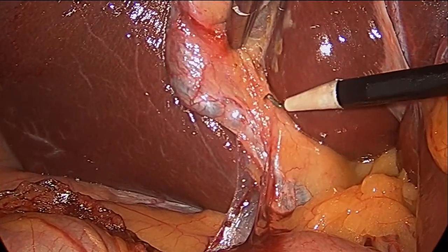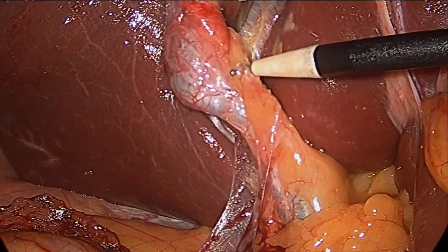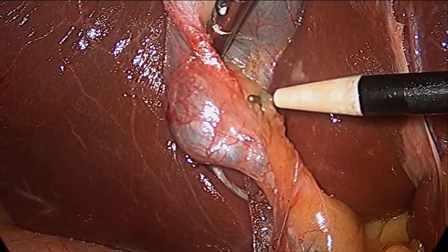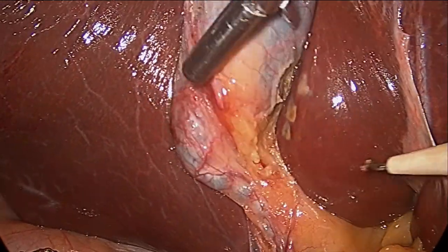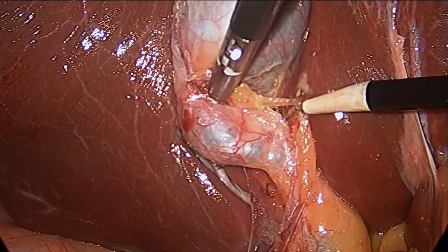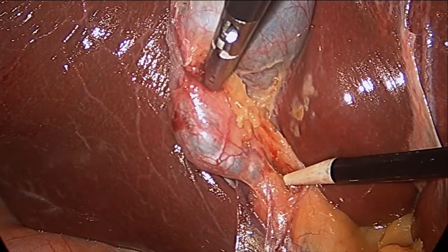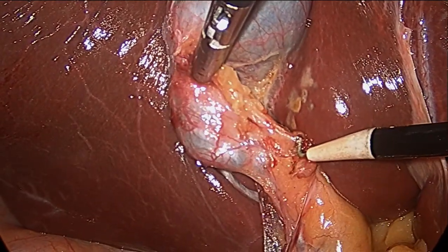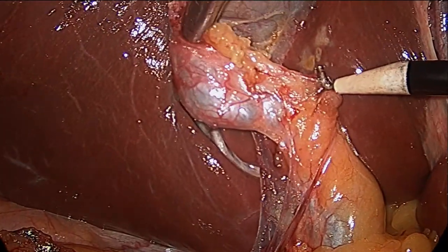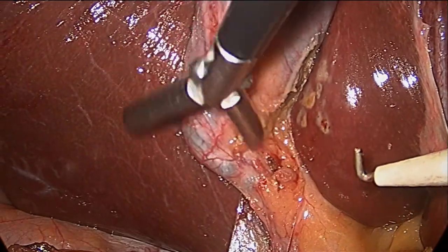When performing a cholecystectomy I always use a hook — I think the hook is the most convenient and safe tool for this operation. Continuing the dissection along the circumferences of the gallbladder neck, a window appears in the tissue and two structures that go into the gallbladder. At this point everything is typical.